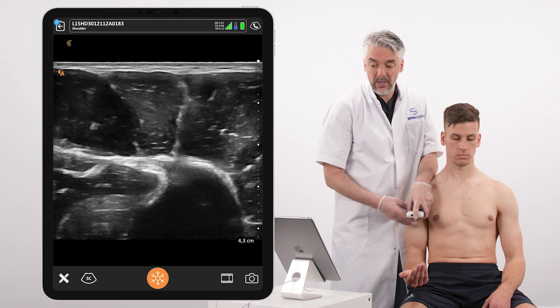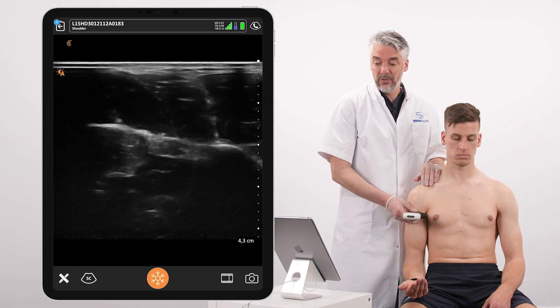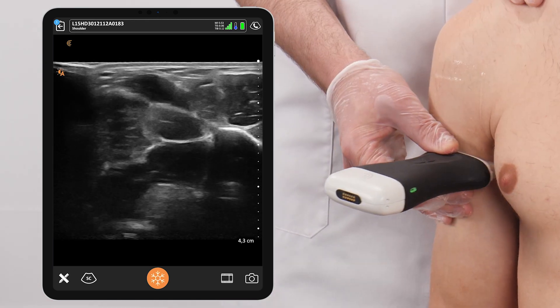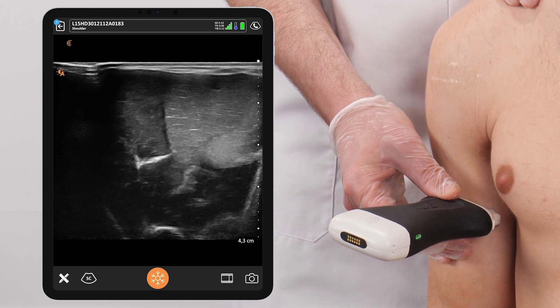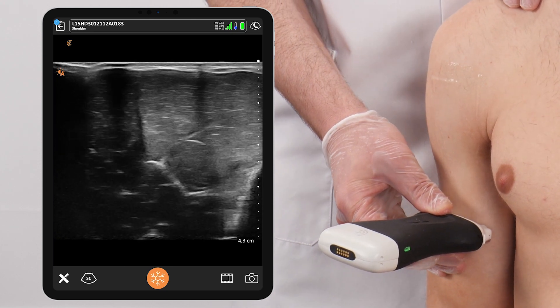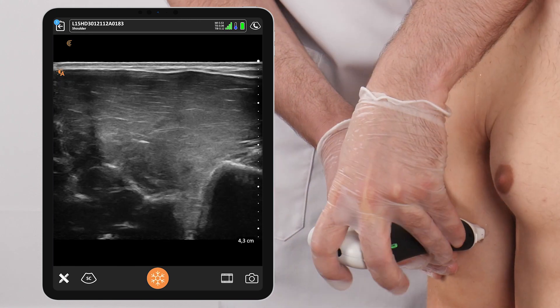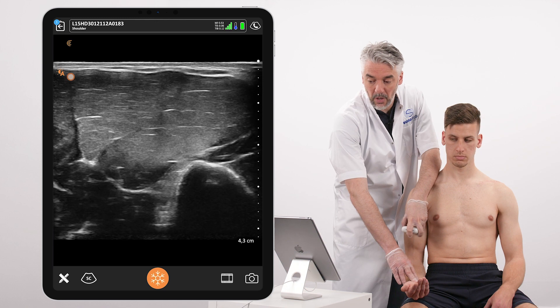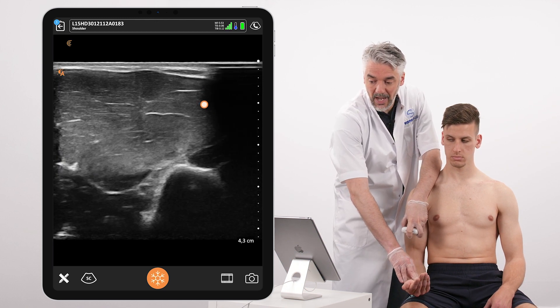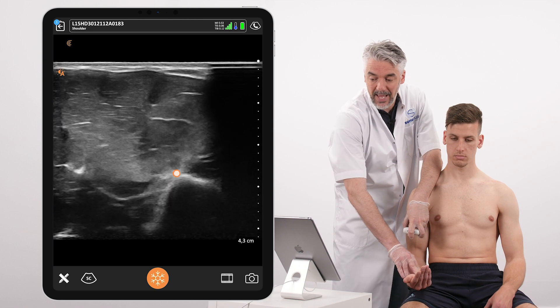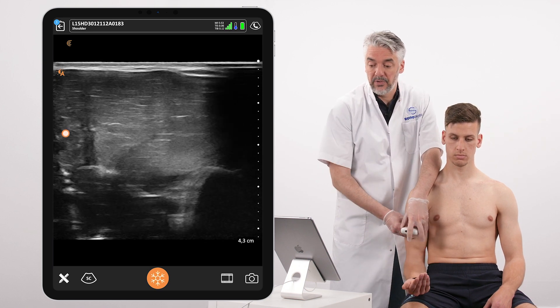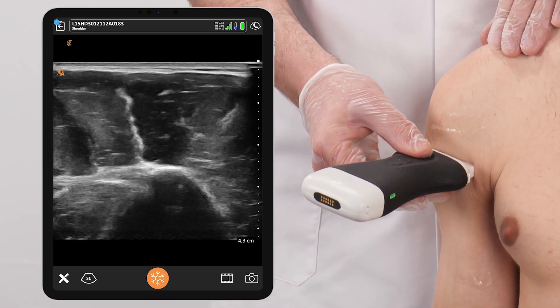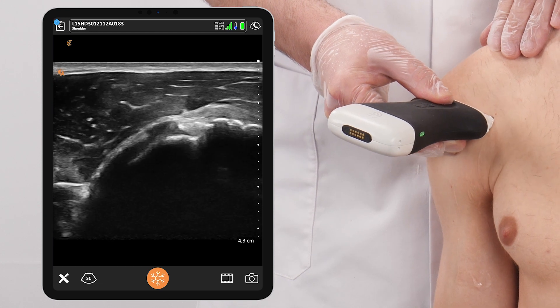We're going to follow the biceps tendon down distally to the junction towards the muscle bellies, where the muscle bellies can be seen beautifully. When looking at the biceps muscles, especially if a complete tear of the long head of the biceps is suspected, I'm going to ask for a contraction of the muscle to see how the muscle volume behaves and also what the echogenicity of the muscle is.